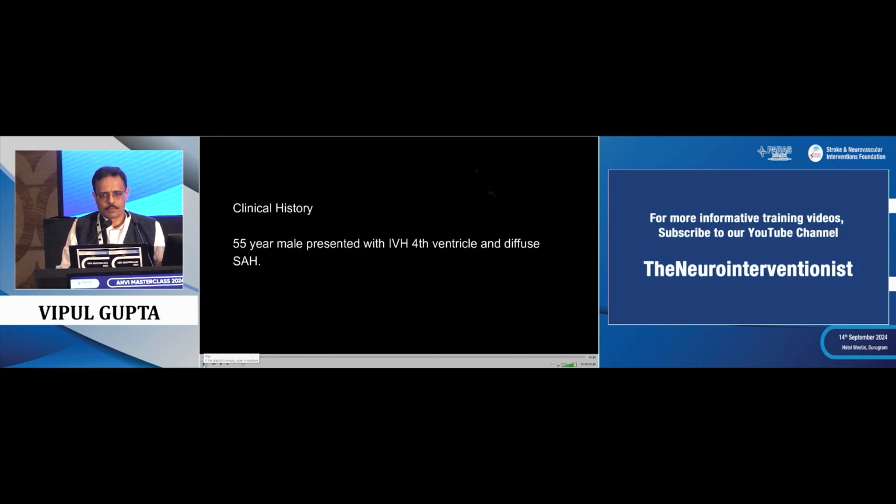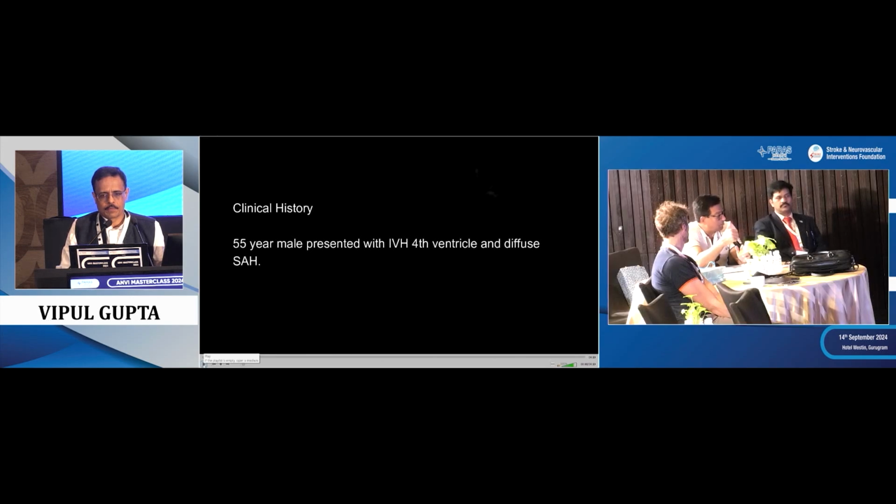Usually if I have a blister aneurysm and I put 2 flow diverters or a flow diverter with a coil, I usually do an angio or a CTA at 24 hours. Usually then I have another one at a week. Then I usually do one at discharge, and then I do one at 3 months. So that's our protocol.